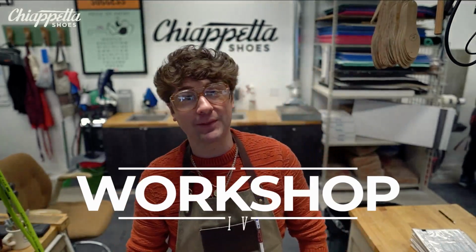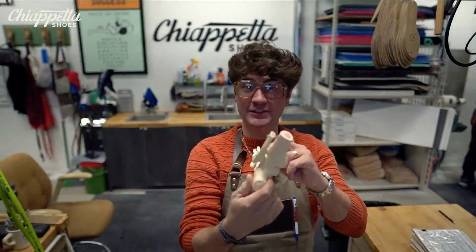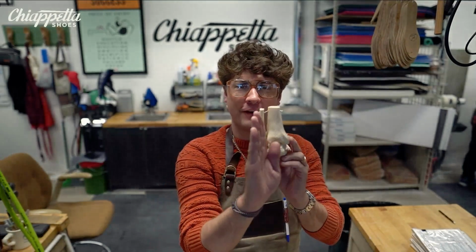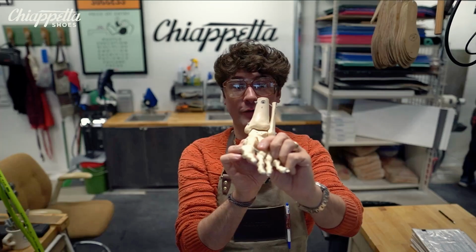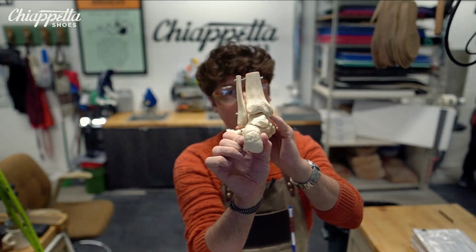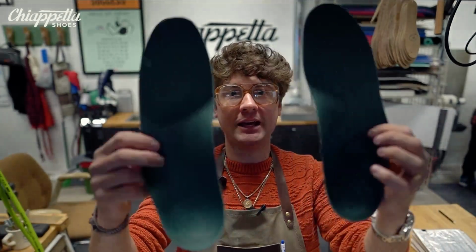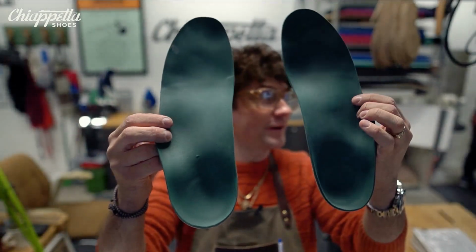This is Workshop Live. We are talking to you about an A5 foot type that is a heavy supinator. We got a ton of rear foot varus, probably 25 to 30 degrees cocked to the outside. The forefoot has a slight forefoot valgus, where we have a slight cock to the inside, and then a large rear foot varus, 25 to 30 degrees cocked to the outside. This guy is all laterals, all right? We got that big expanded fifth metatarsal area right on the outside of the foot here.